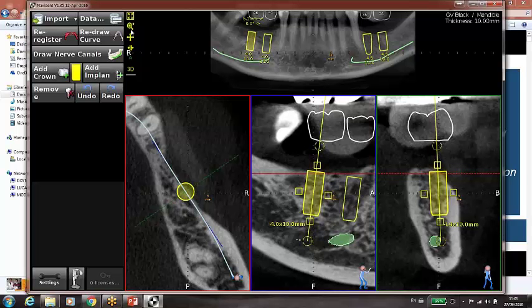Eventually a cotton roll allows the patient to adjust on the cotton roll and not bite and overbite the denture. So that's the most important. Planning is a piece of cake. You've seen it, piece of cake. Big deal. Yes, it is.